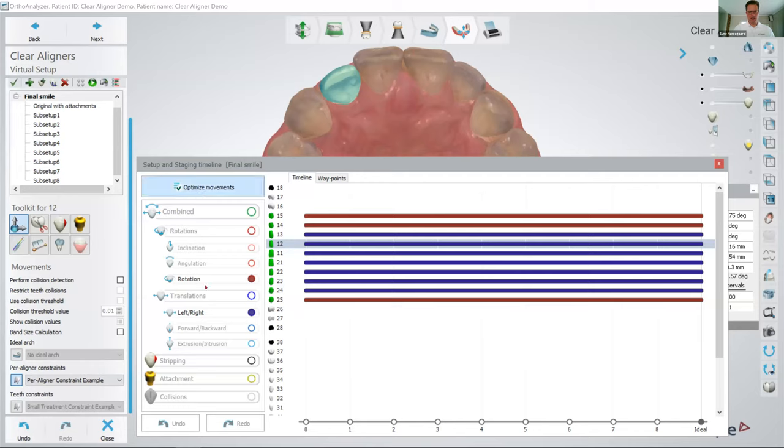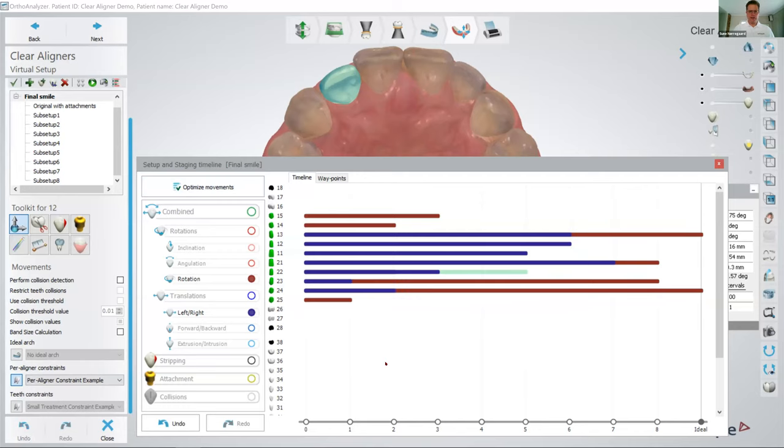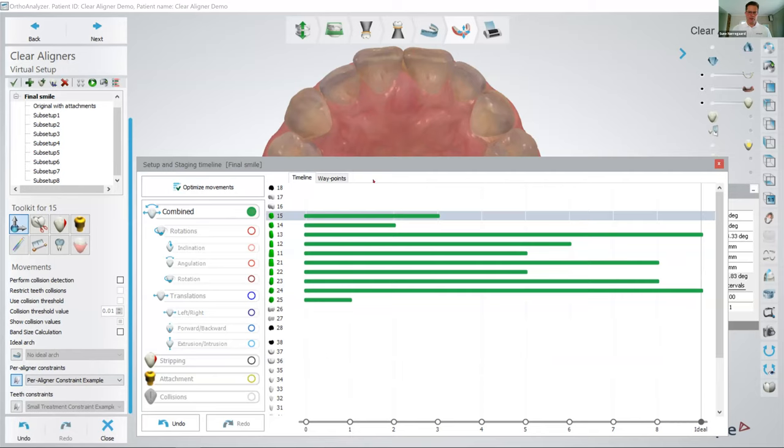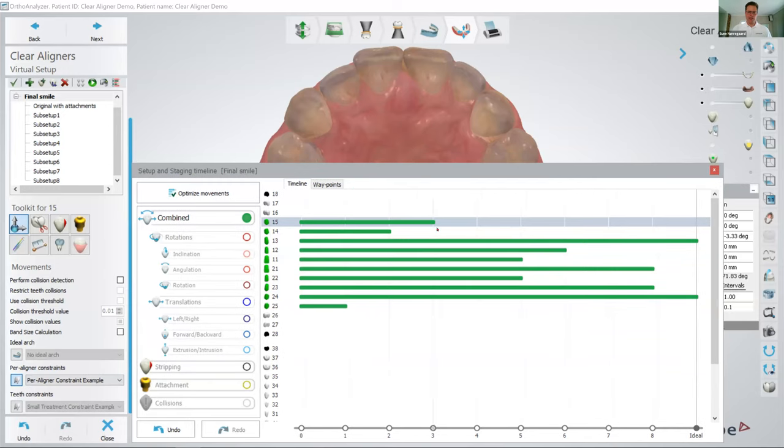So if I click this button here, then the scenario suddenly looks completely different, because tooth number 25 and 15 here are actually able to finish their tooth movements in 3 aligners. The only 2 teeth that require all 9 aligners are tooth number 24 and tooth number 13.